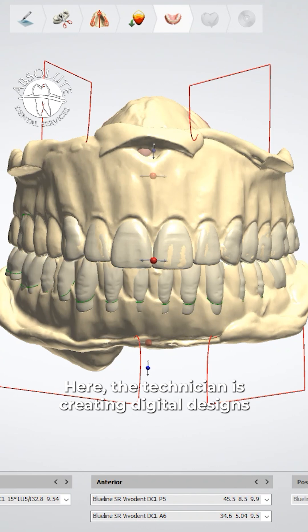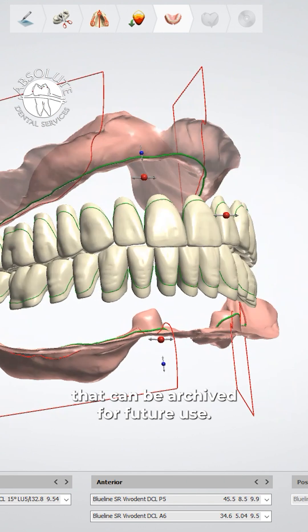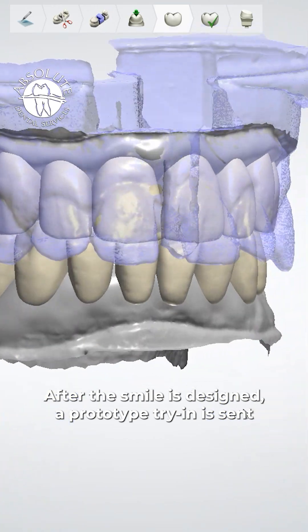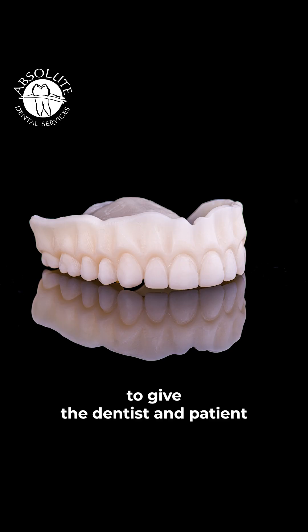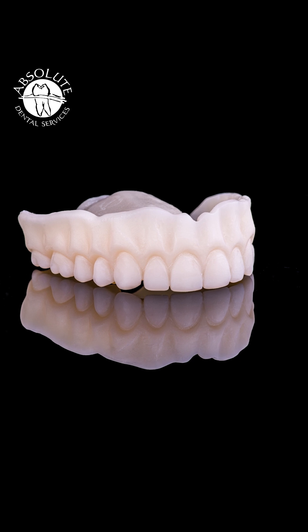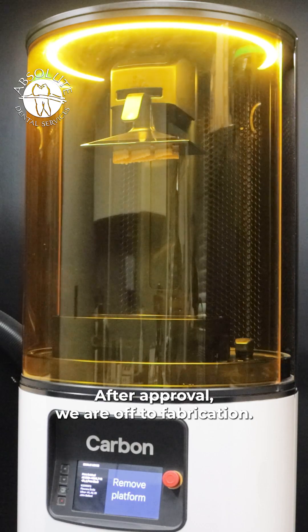Here, the technician is creating digital designs that can be archived for future use. After the smile is designed, a prototype try-in is sent to give the dentist and patient a chance to take our denture for a test run. After approval, we are off to fabrication.